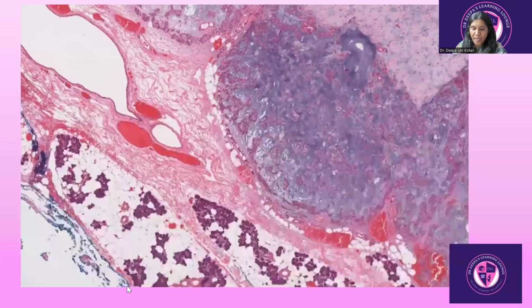So today we will be discussing pleomorphic adenoma. Pleomorphic adenoma, as you all know, is a benign tumor of the salivary gland which affects majorly the parotid. Almost 80% of the cases occur in the parotid. So what you're seeing here in this area is the normal parotid gland anatomy, and this is the tumor area. Without much ado, let me just start this whole slide image.